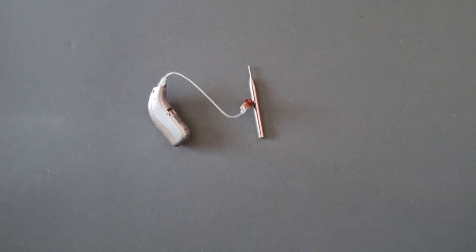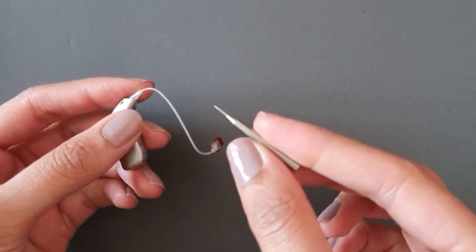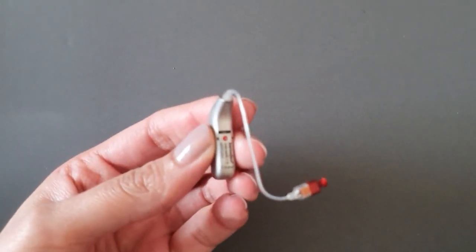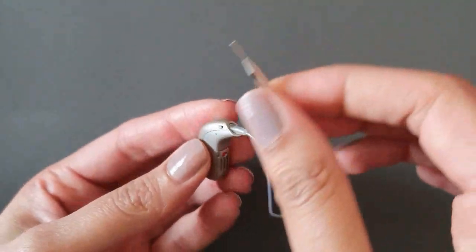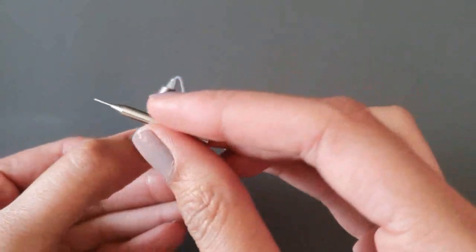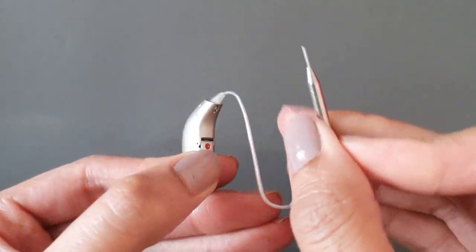First of all, what we need is your hearing aid and a little safety pin or a paper clip. You can see that the hearing aid speaker wire is attached to the hearing aid from the top, and what we need to do is find this portion here of the hearing aid, as this is where you're going to unclip the speaker wire.